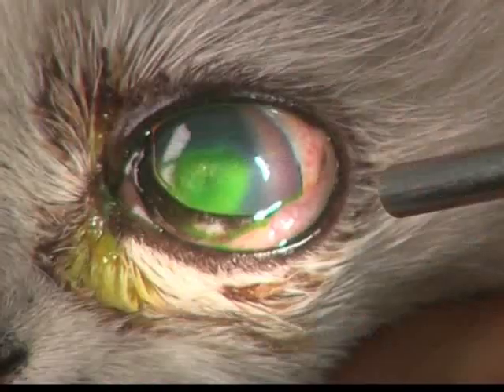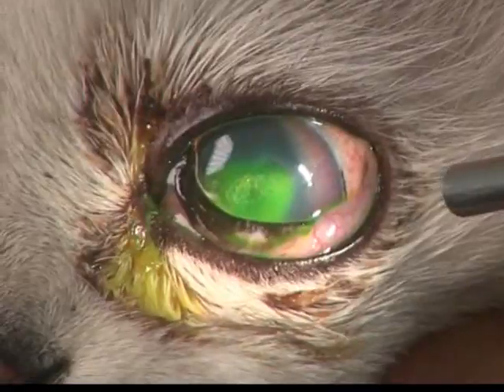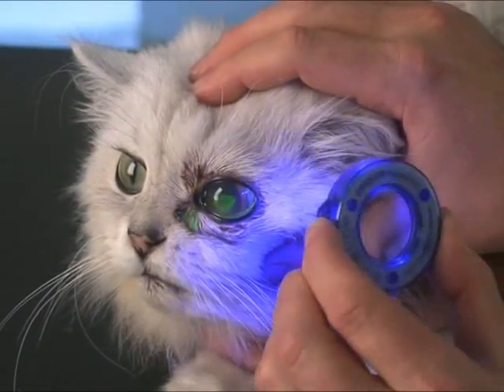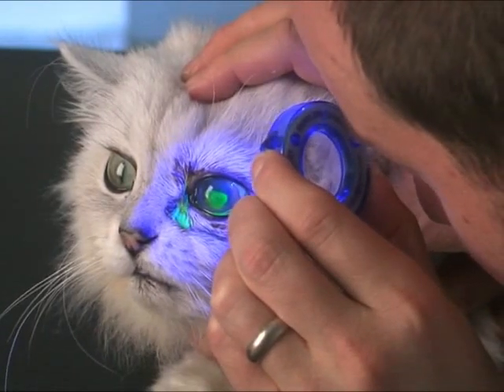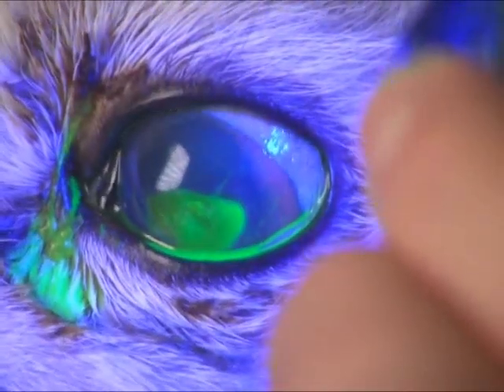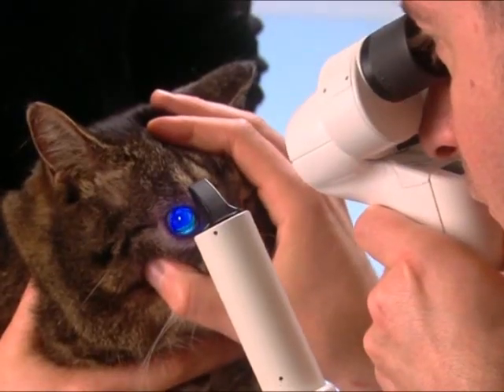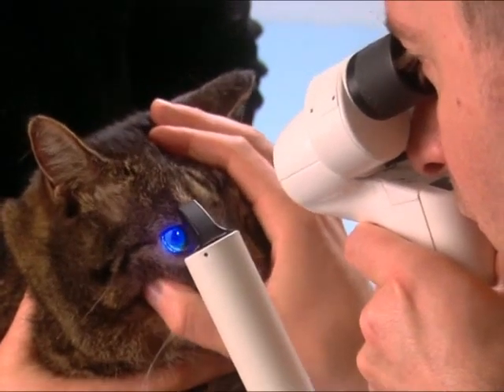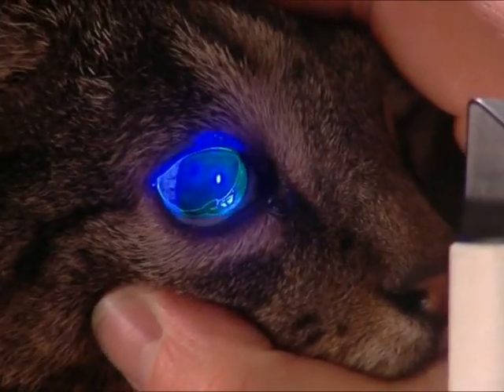While fluorescein staining can often be seen under normal white light, the eyes should also be checked with a suitable blue light. This is important for detecting smaller ulcers and facilitates assessment of the lesion. Conversely, when there is no ulceration, the blue light helps to confirm the absence of fluorescein uptake.